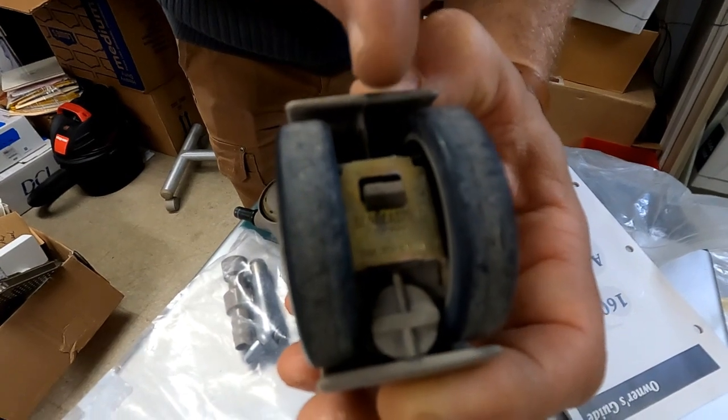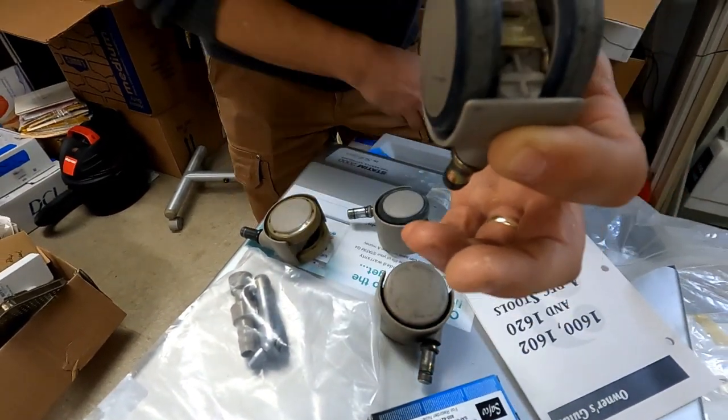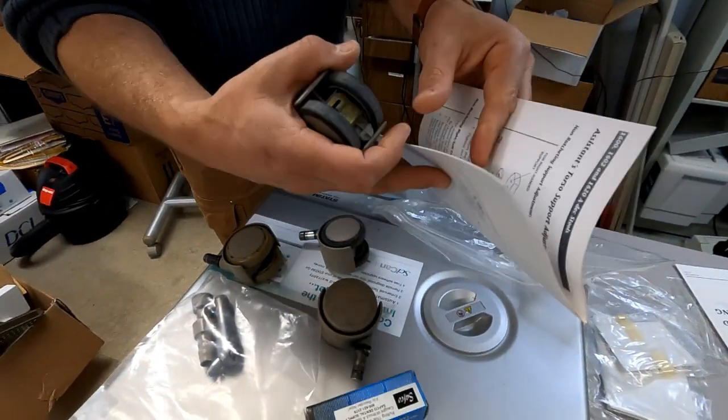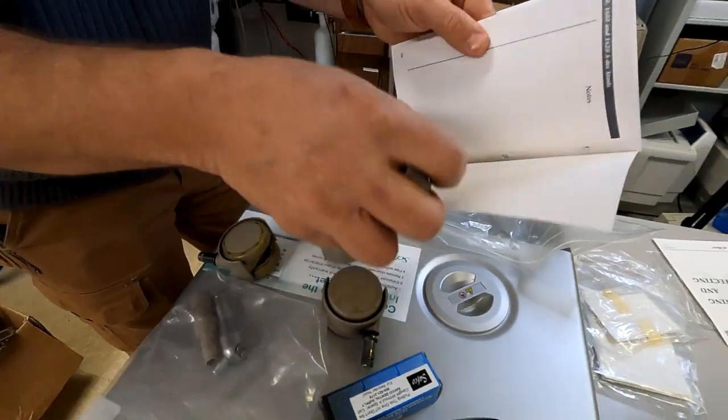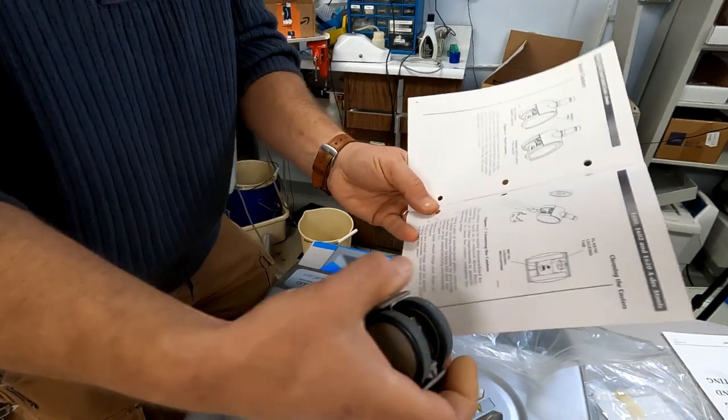That little brass thing is going to come out, and then these 2 wheels are going to come out. So I'm going to show you how to do that right now. And actually what we're going to do is follow the instructions in the book, because this is how I would recommend that you do this.